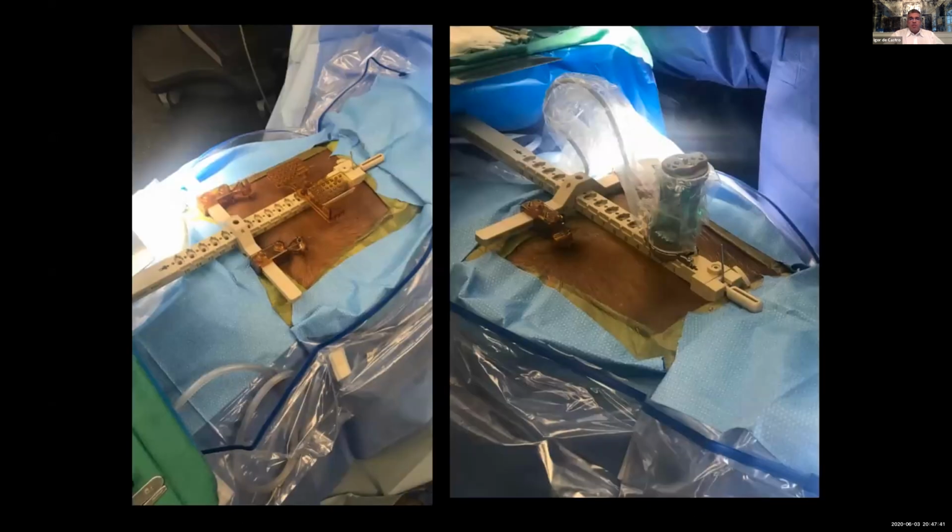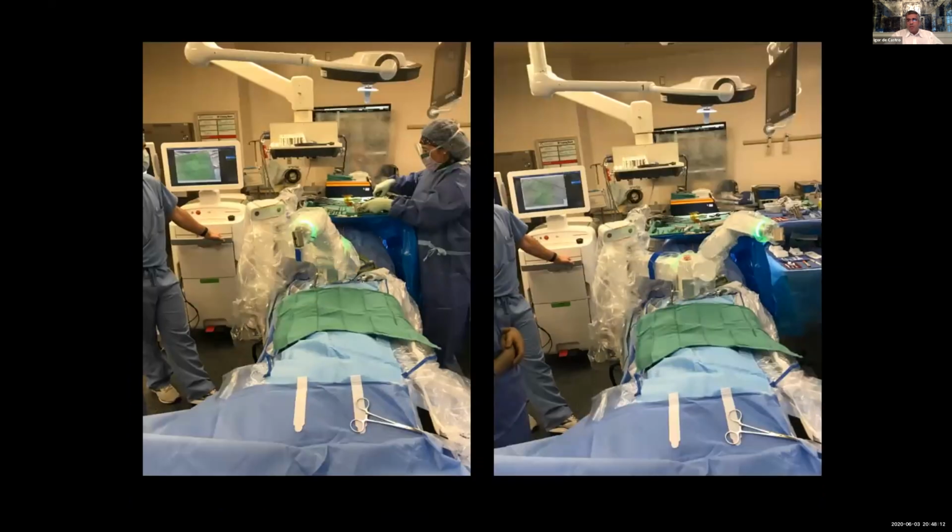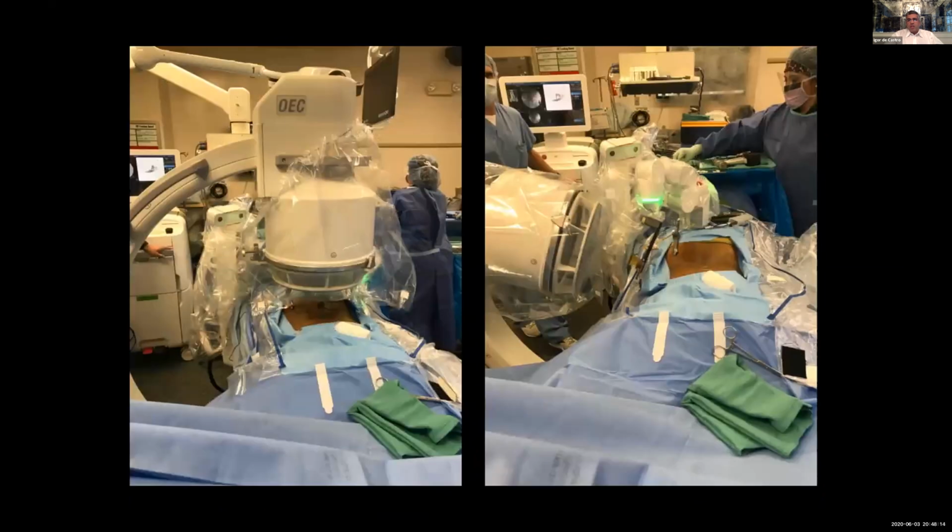So just again to introduce, that's the old version. That's the very first version of the Renaissance robot. It looked like a little can of Red Bull, and you have to mount that platform on the patient's iliac crest and spinous process, and that robot is going to contour, and you attach the arm, and you fire those K-wires from there. And that is the new generation. You put the pin on the superior iliac crest, and the robot is attached to the table and the patient, and then the robot moves around and gives you the trajectory, as I'll show here.